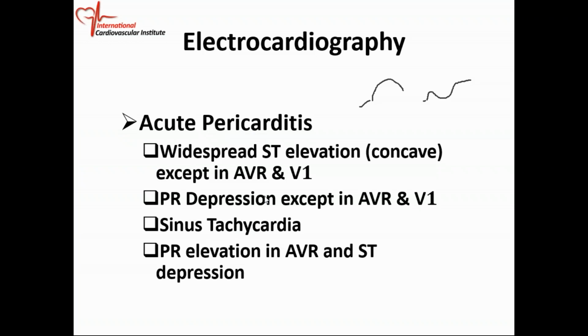So, widespread ST segment elevation, except your AVR and V1, where instead of ST elevation you get elevation of your PR segment in those leads.